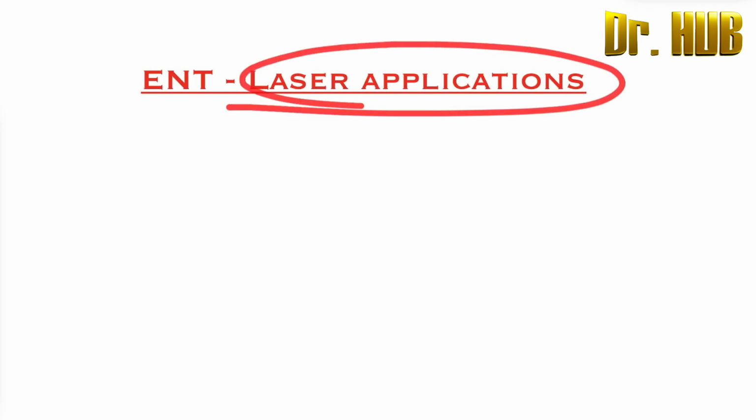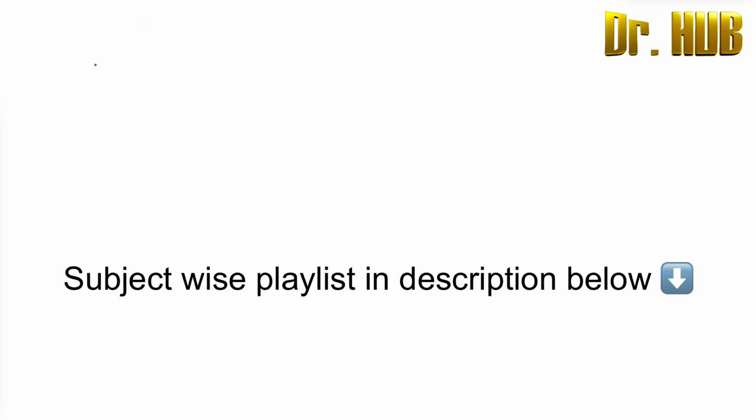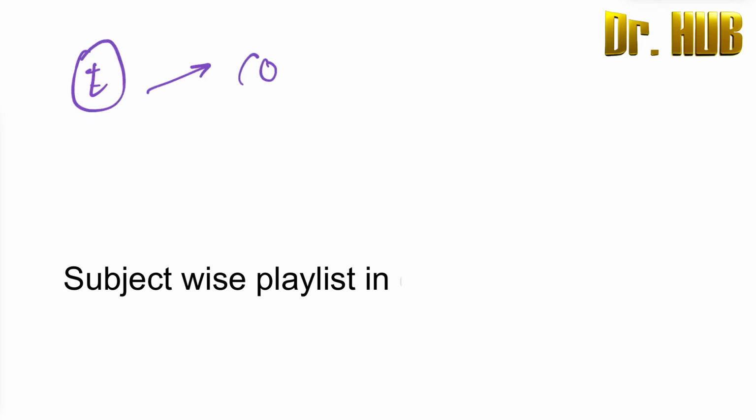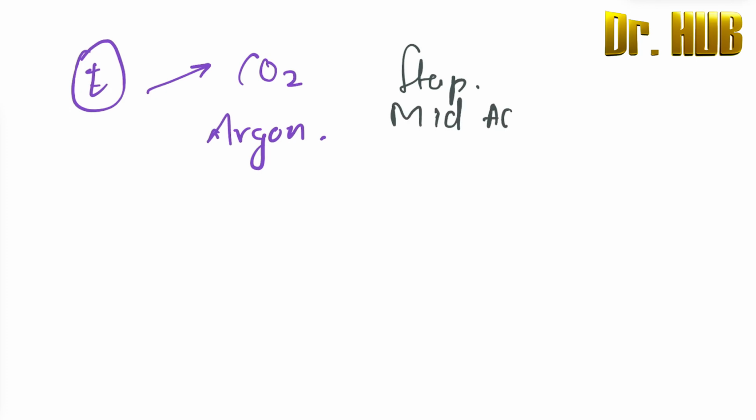We are looking at laser applications in the ENT. So what are the lasers used in terms of the ENT? First, we look at the ear. In terms of the ear, there is use of carbon dioxide and argon. So where are they used? They can be used in stapedectomy as well as middle ear adhesions.